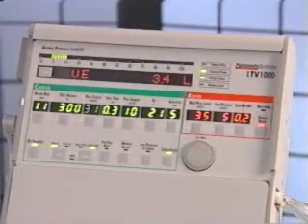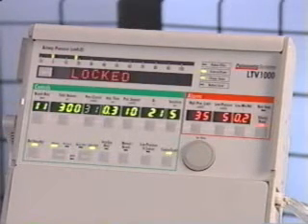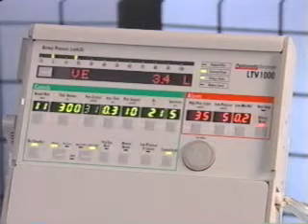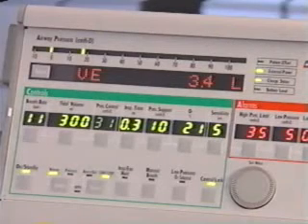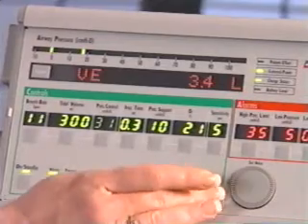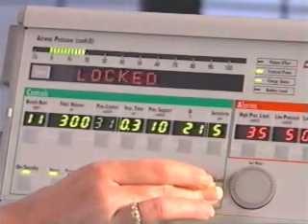The locked message is displayed when a button is pressed while the controls are locked. No audible alarm is given. When a locked message is displayed, the locked message is flashed in the display window for five seconds or until the controls are unlocked. To unlock the controls when Easy Unlock is selected, simply press and release the Control Lock button. To unlock the controls when Hard Unlock is selected, press and hold the Control Lock button for three seconds.